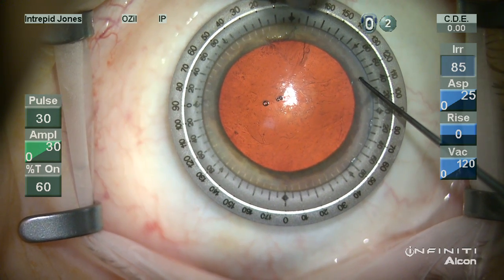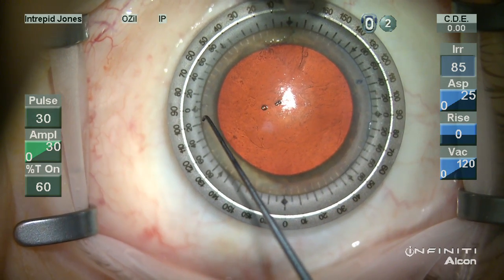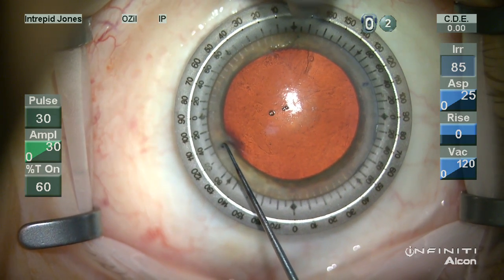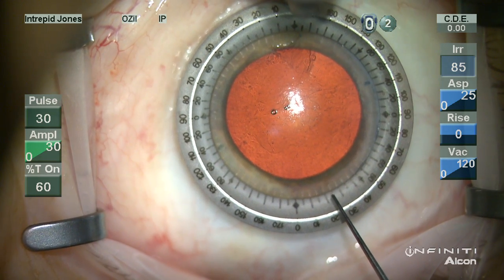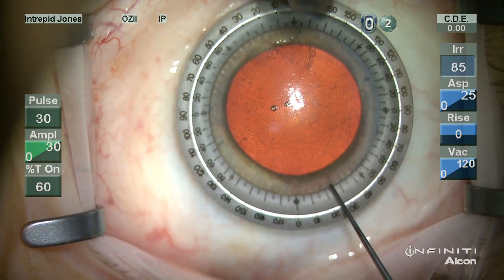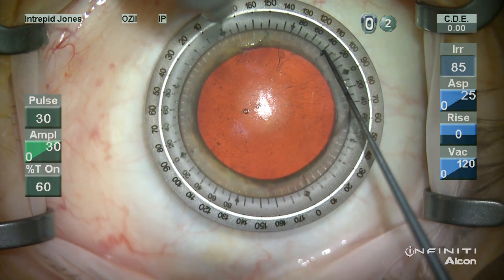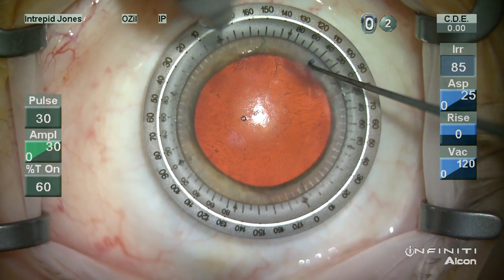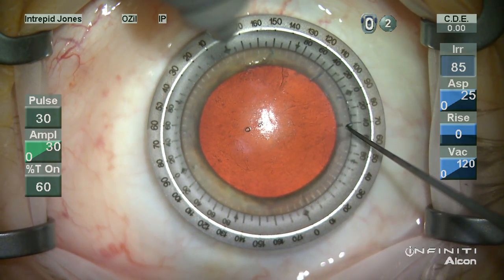Using the same Sinski hook I'm going to denote the 115 degree axis that can be read on the outer bevel of this reference ring. I also ensure that I have proper placement of my main wound with a mark at 25 degrees, so it's 90 degrees off from our intended relaxing incision. The ring is then rotated and the marks are placed for a 45 degree arc, measuring out on each side of the reference mark made in the previous step.